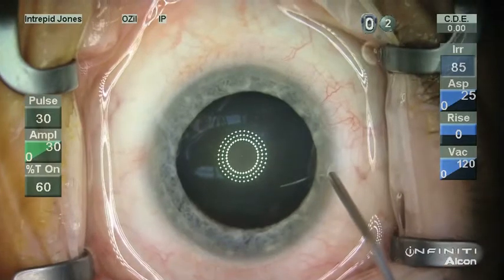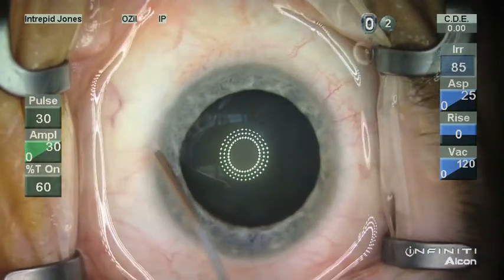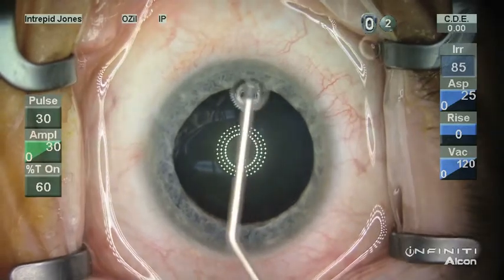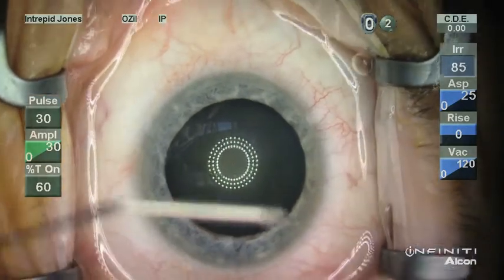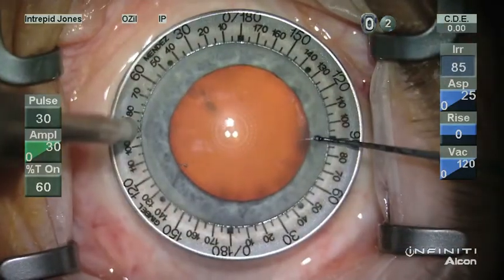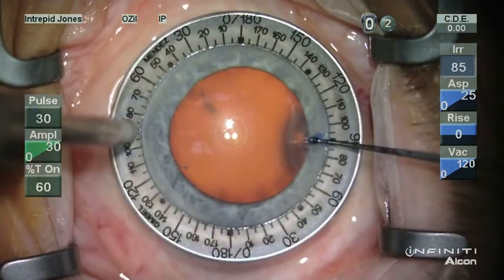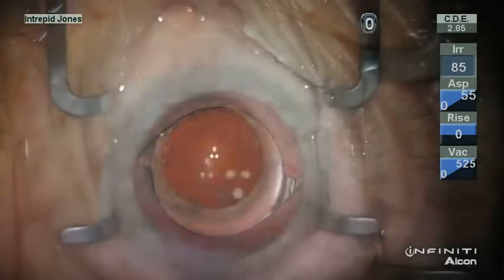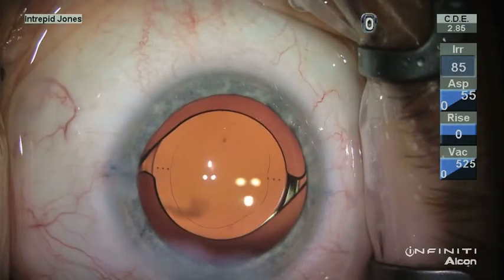Here is a fairly typical use of the keratoscope. You note here that the reflex is oval in nature, and by bisecting it using the cannula, you can more readily see the astigmatism. Qualitatively, this aids in location of the astigmatic correction.